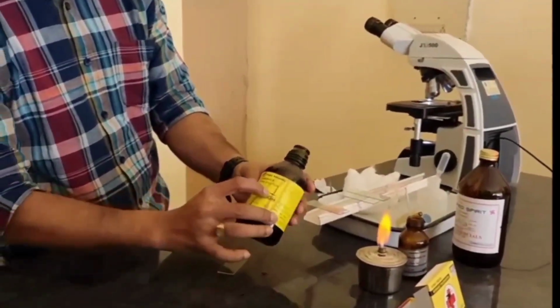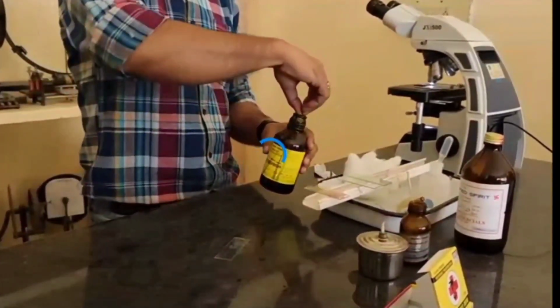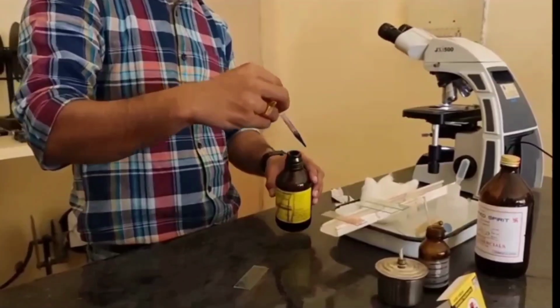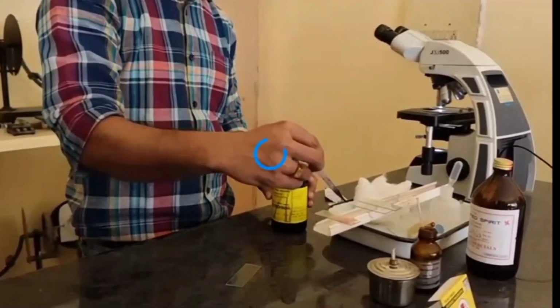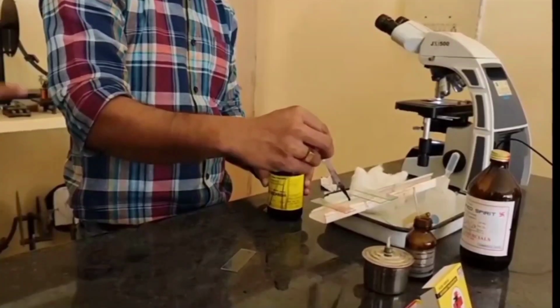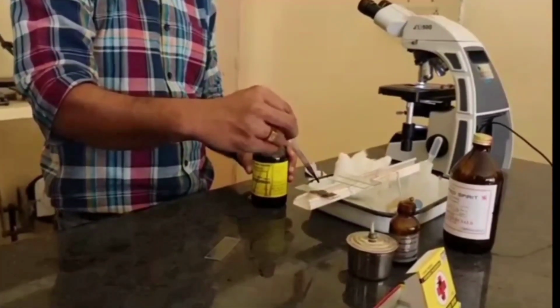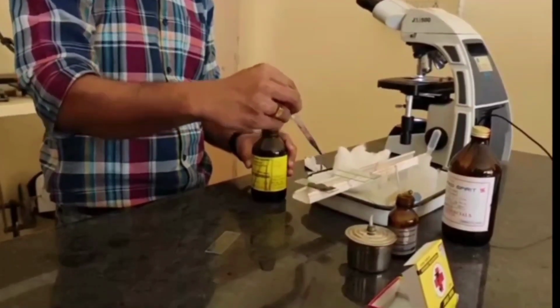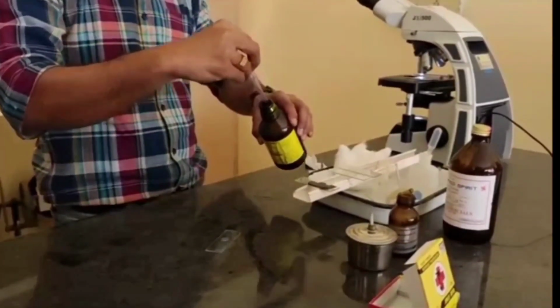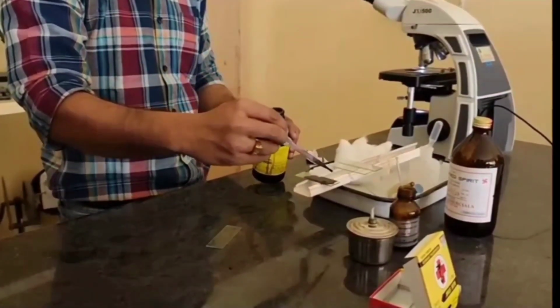Now this is Leishman stain. I have already told you about the composition of Leishman stain. Please read; you must know the composition and function. Now I am going to put Leishman stain on the blood film, drop by drop to cover it completely, and I will count the drops. 1, 2, 3, 4, 5, 6, 7, 8, 9, 10, 11, 12, 13, 14, 15, 16.